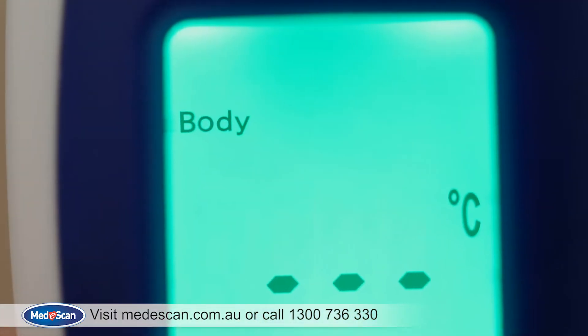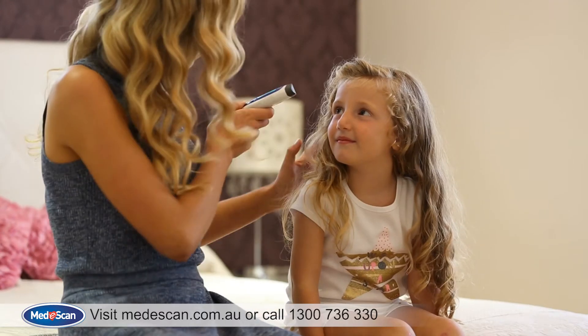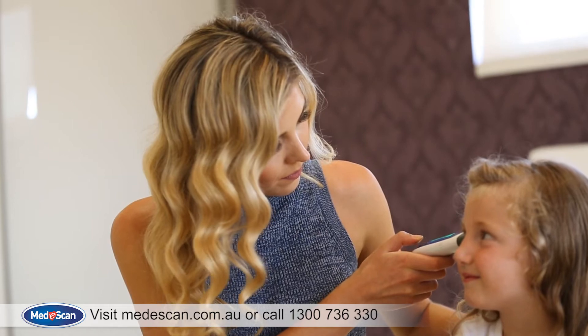To measure body temperature, please make sure the thermometer is set to body mode. Simply point the MediScan Touchless Thermometer directly at the right temple only, within five centimetres of skin, and press the Scan button to get a reading.